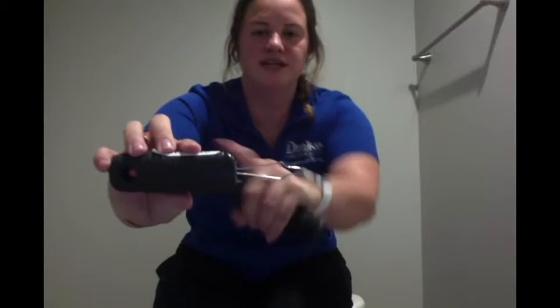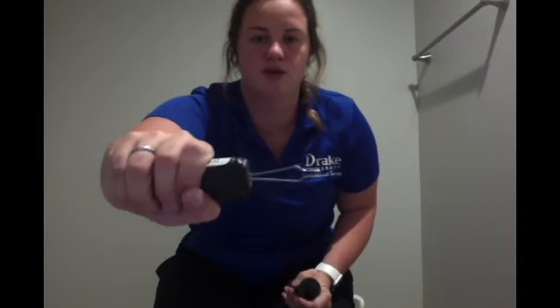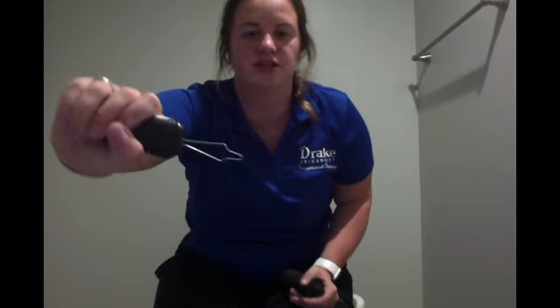This is going to be your stabilizer, which you're going to hold on to, and this is the wire filament which you're actually going to use to go through the button hook, attach your button, and pull through.